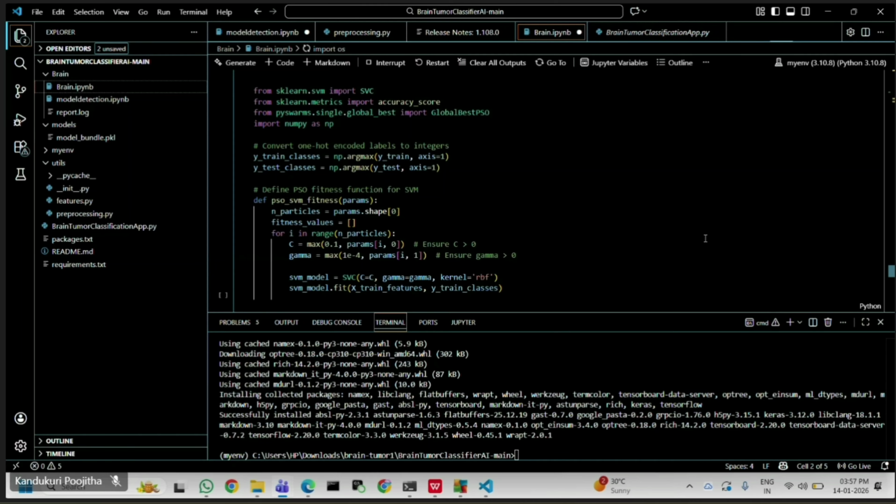During training, SVM learns the boundaries of different classes, and the trained model was tested on the test data. We used SVM for tumor classification, with 4 types of tumors, and evaluated 4 types of performance. The final output was the predicted class for each image.